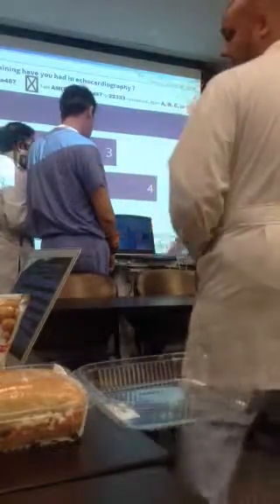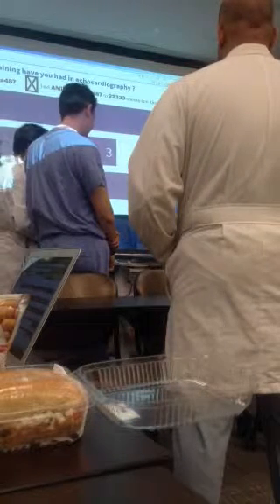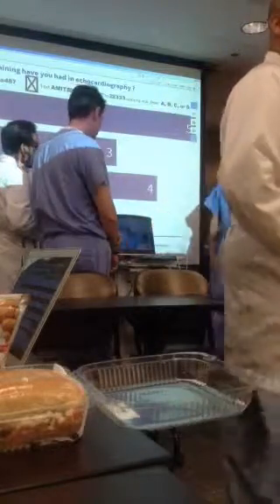So you can see it takes a few minutes to boot up. We'd like to request, everybody likes to put stickers here. Please don't do that, it's ruining our machine. I mean, it doesn't come off. So find a better place to put your stickers.